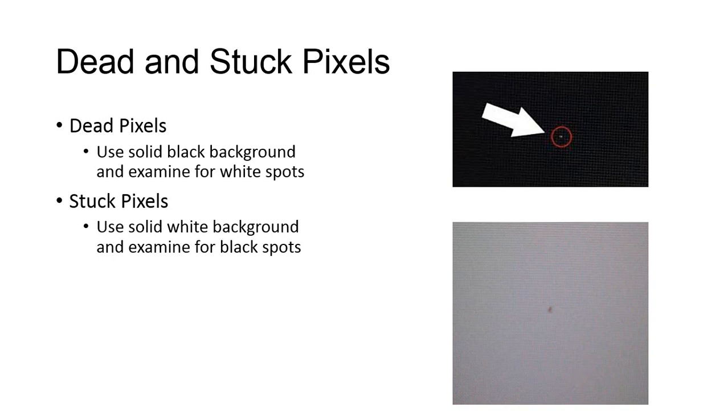The same methods can be used for color monitors using red, green, and blue fields. These can sometimes be fixed by gently massaging them with your fingertip, but they can also be damaged by finger pressure and fingernails, so it should not be attempted with expensive workstations.